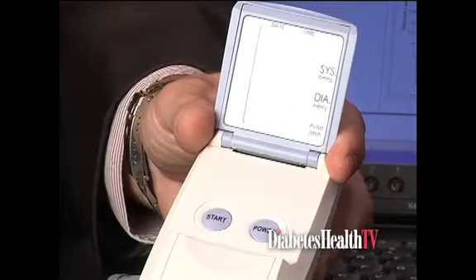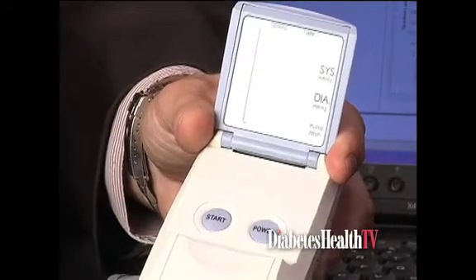We've also got a blood pressure cuff that communicates with our virtual tracker, because a lot of patients that have diabetes also have hypertension. Oh, this is a blood pressure machine? Yes. Okay. Oh, it plugs into what you have with the doctor. I see. Right. And how does it talk to this? There's a serial port. There's a cable that connects these two. Okay. And that automatically downloads the information, sends it over to our server in the same format, and then we're able to showcase it and archive that.